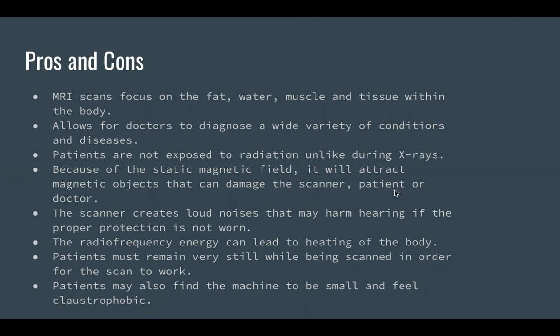The scanner creates loud noises that may harm hearing if the proper protection is not worn. The radio frequency energy can lead to heating of the body. Patients must remain very still while being scanned in order for the scan to work, and patients may also find the machine to be small and feel claustrophobic. But when the proper precautions are taken, the scans are very beneficial in the medical field, because without these scans, you wouldn't be able to diagnose certain conditions and diseases. And that's all.